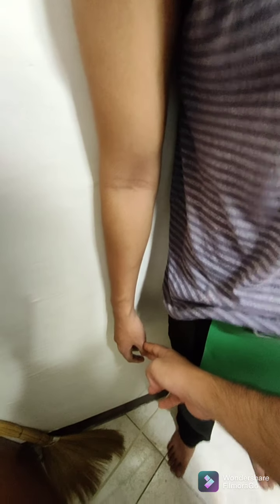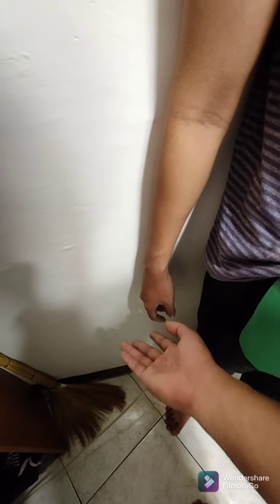Pero makakaya siya mag-stand up. So, erect ang position ng patient. So, neutral ang rotation. Meaning, ganito lang ang normal niya na orientation ng kamay. Hindi siya ma-internally rotate or externally rotate. Kaya siya tawag na neutral rotation. So, the shoulder still against the IR.